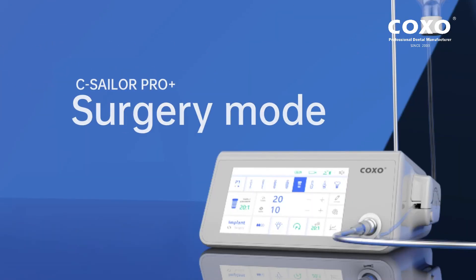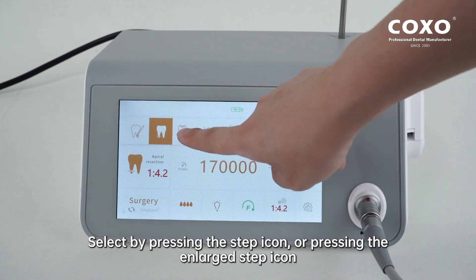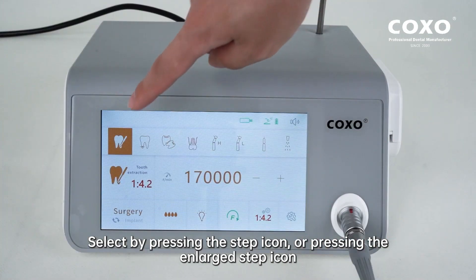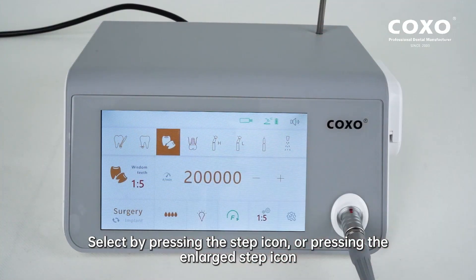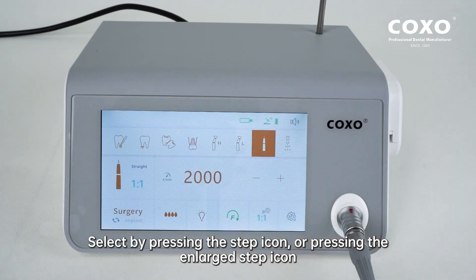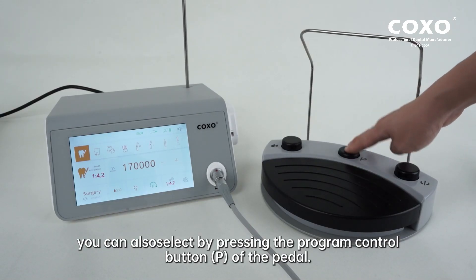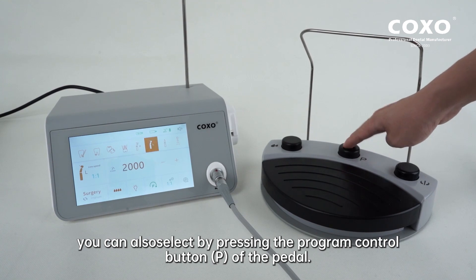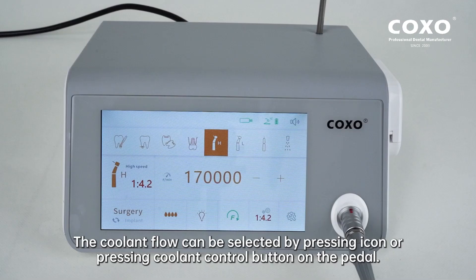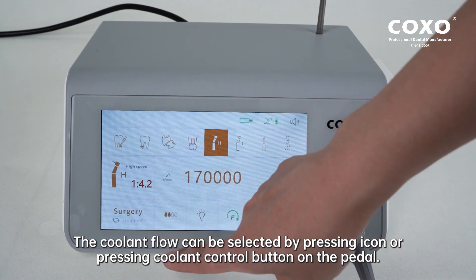Surgery Mode: press the icon to switch to surgery mode. Select by pressing the step icon or pressing the enlarged step icon. You can also select by pressing the program control button P of the pedal. The coolant flow can be selected by pressing the icon or pressing the coolant control button on the pedal.